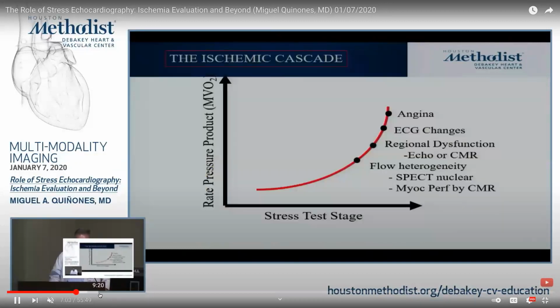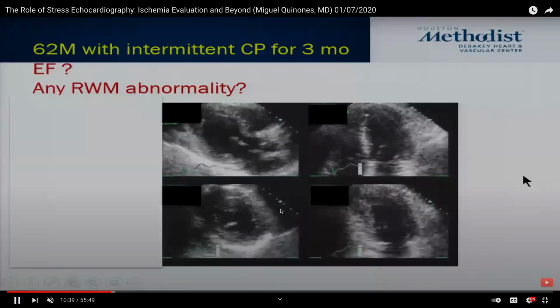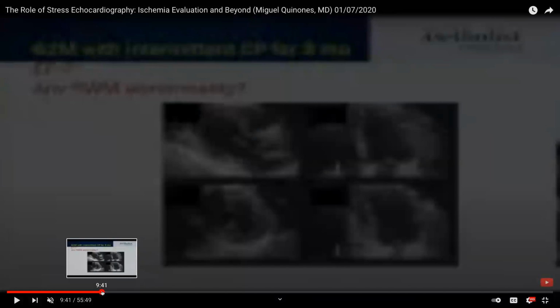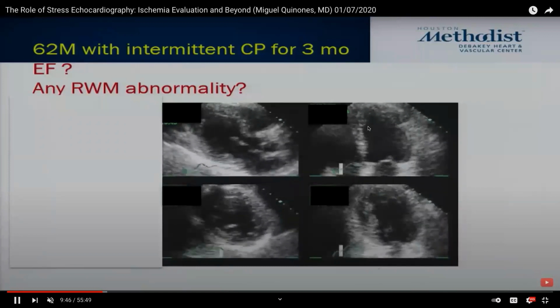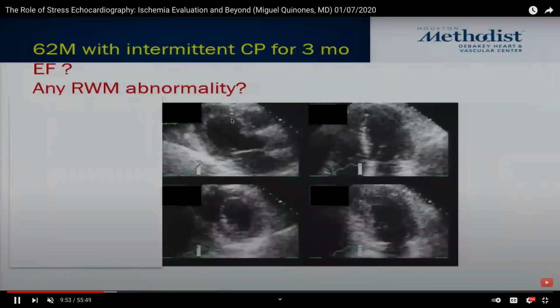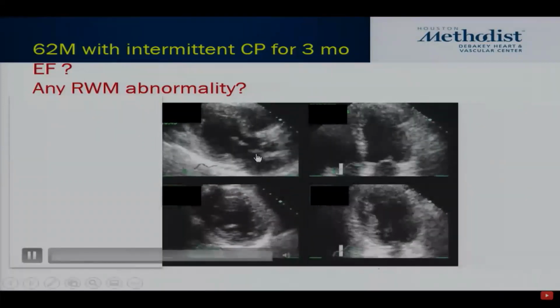I'm just going to keep this on since we're here. So here's an example of a patient who doesn't look entirely normal. Again, this looks a little down here. The whole chamber itself stays kind of open. Here you have a function that's down. So the question is, why is this patient abnormal?